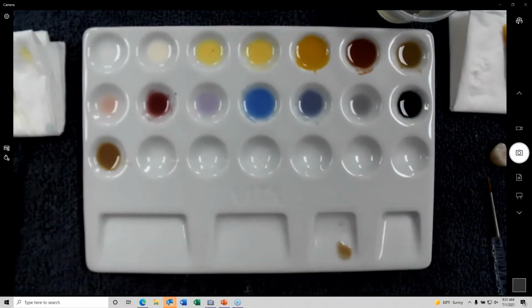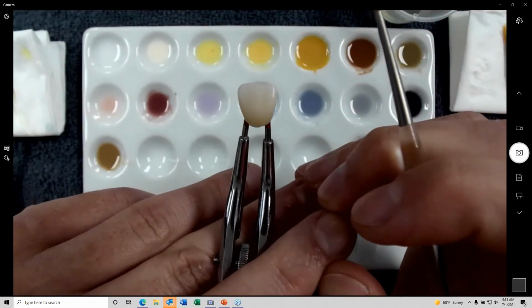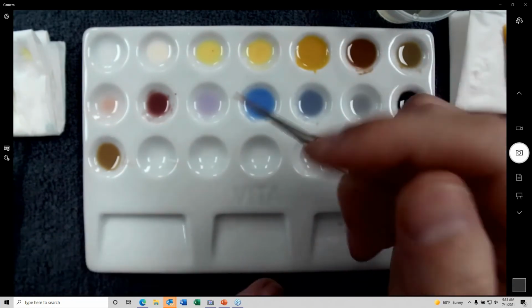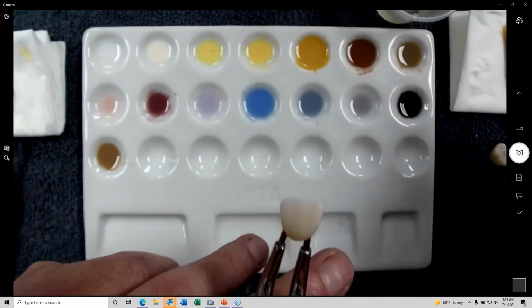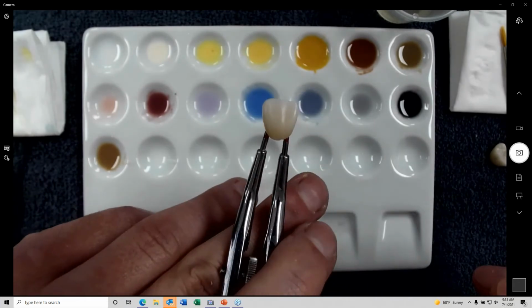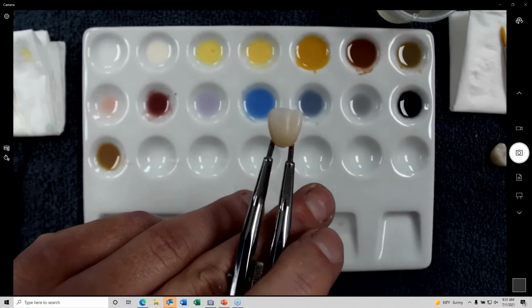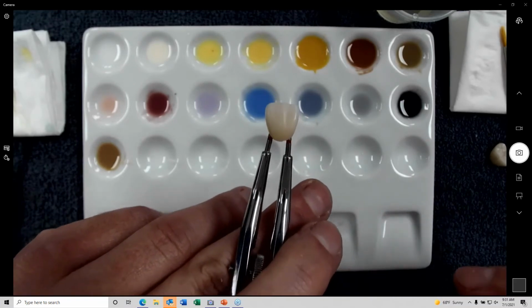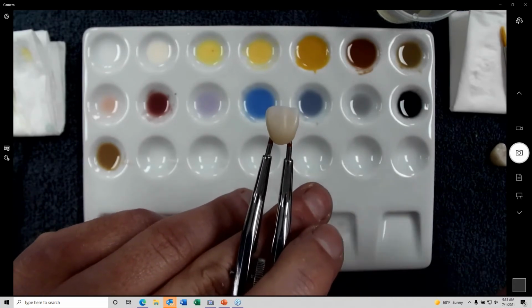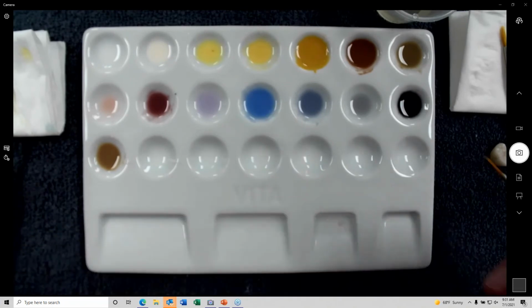But again, if we're going to use the fluoro glaze, it comes in a spray. So what a lot of the clinicians I know do, that are trying to do these chairside and trying to save time, they don't want to do the two-step firing of a stain fixation and then a glaze.